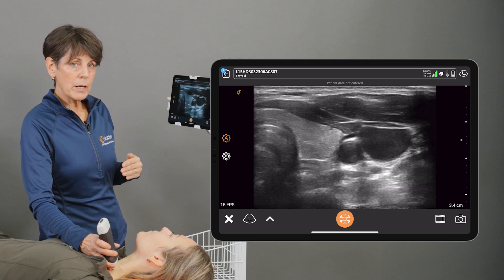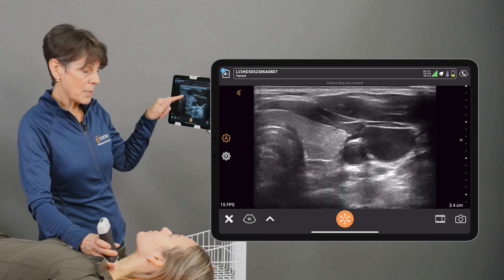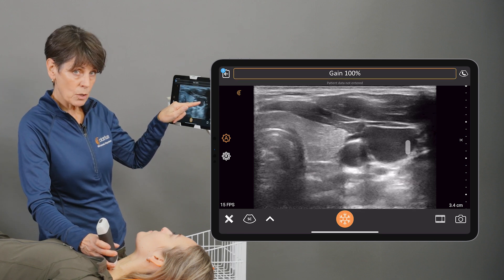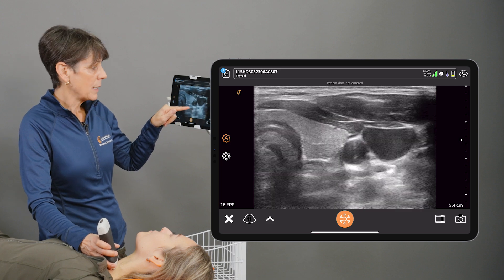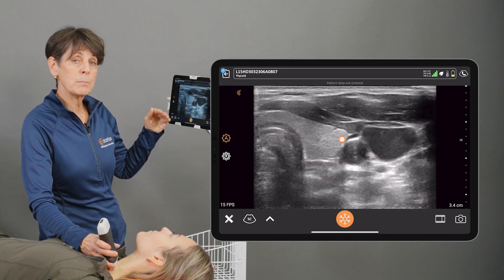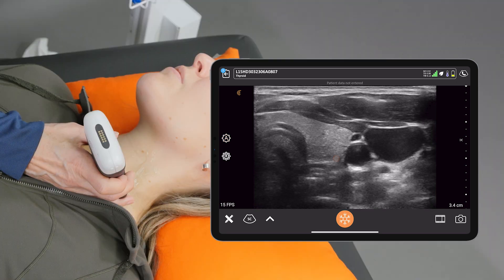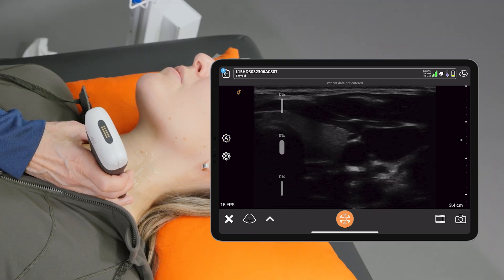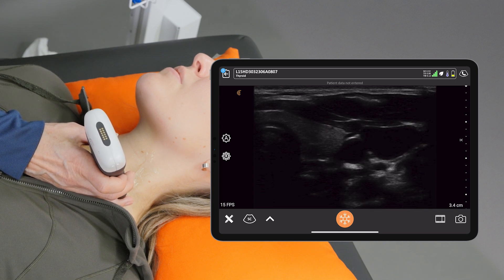Because we all look a little bit different under ultrasound, sometimes we may need to increase that gain or brighten our image. What that can do though is fill in dark areas that are supposed to be black falsely. Conversely, if we have our gain too low we're not getting any signal coming back to the scanner and our image is way too dark.